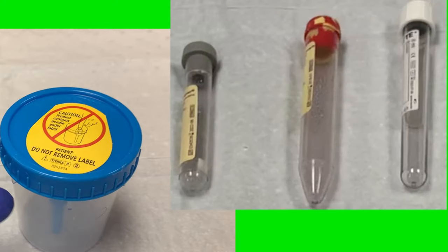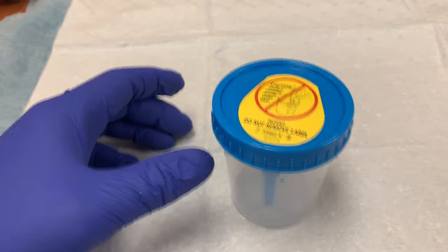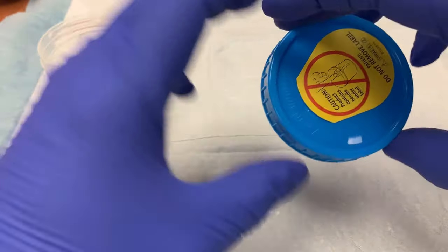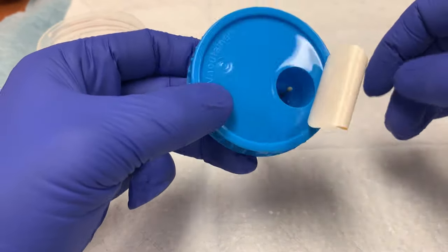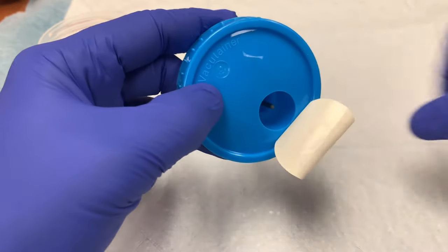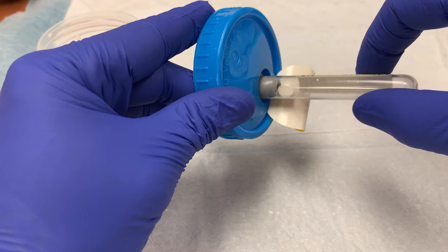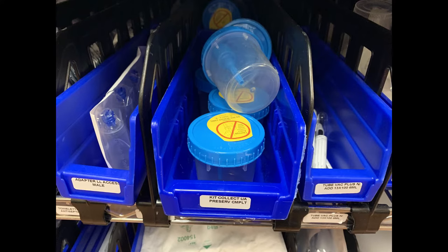The specimen cup used at St. Mary Mercy Hospital is compatible with these vacutainer tubes. It is a small cup with a blue lid. The lid has a straw that protrudes to the bottom of the cup. On top of the lid is a yellow sticker that conceals the vacutainer port, which contains a rubber shaft that protects and conceals a needle. To use this cup with a vacutainer tube, simply insert the top of the tube into the opening and push down until the needle enters the tube.